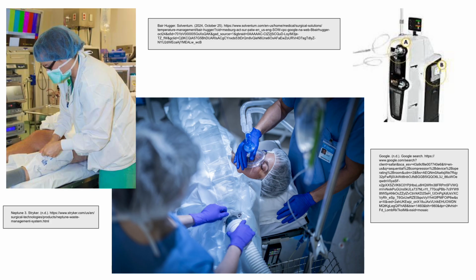Surgical equipment needed for the case would be sequential compression devices with disposable leg wraps, forced air warming blanket or mattress pad or the Bair Hugger, suction, ESU, a regular OR bed, head in normal position, anesthesia equipment, and theater lighting.